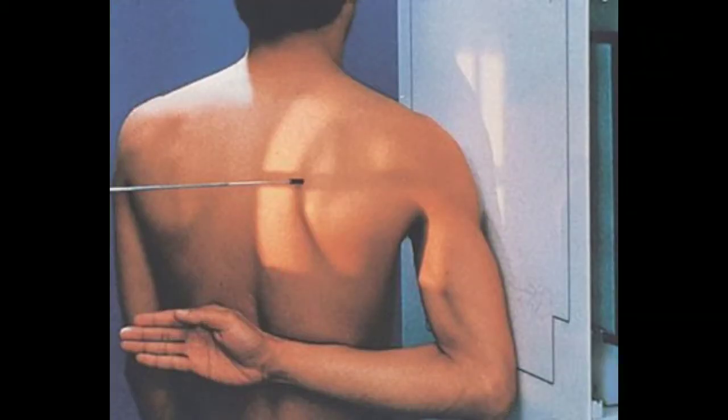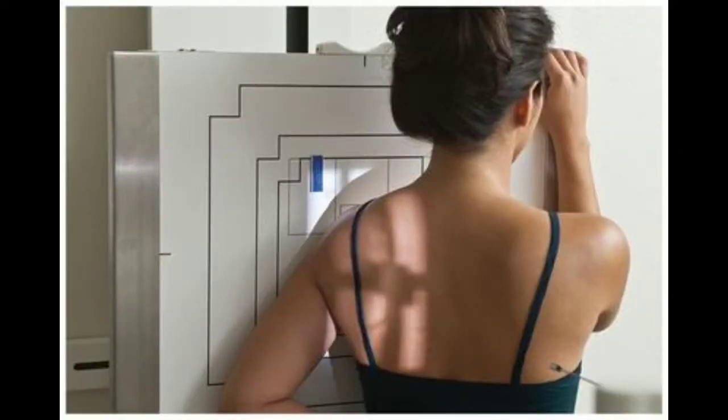For our lateral scapula, we'll have a 10 by 12 inch image receptor lengthwise. We'll have the patient face the Bucky. We'll rotate the patient about 45 to 60 degrees toward the affected side, whether it's a right scapula for RAO or a left scapula for LAO. And the position of the arm will change according to the area of interest.